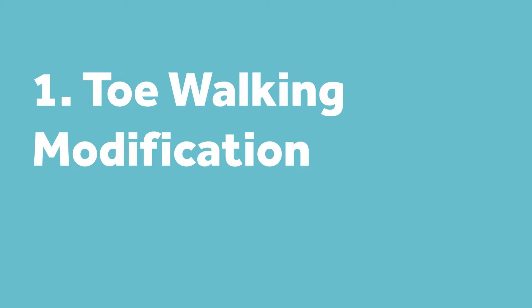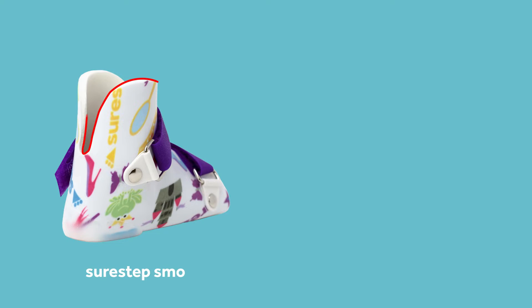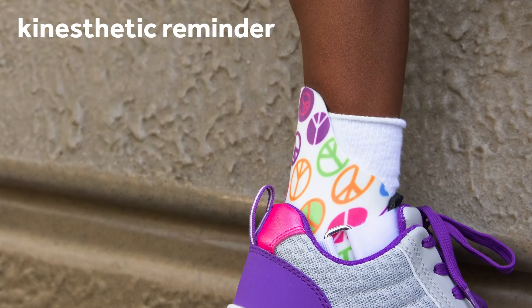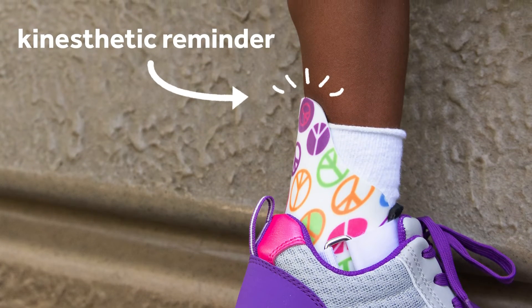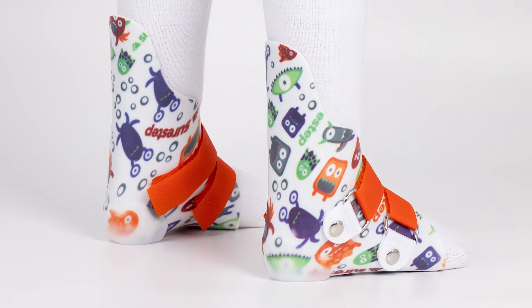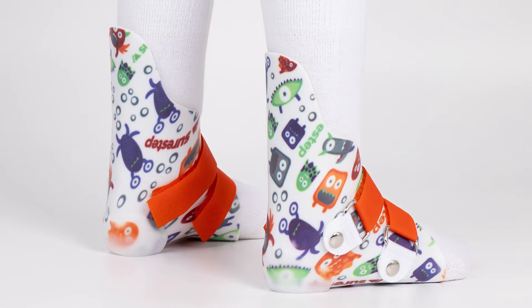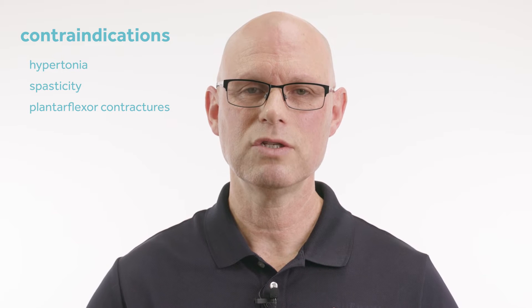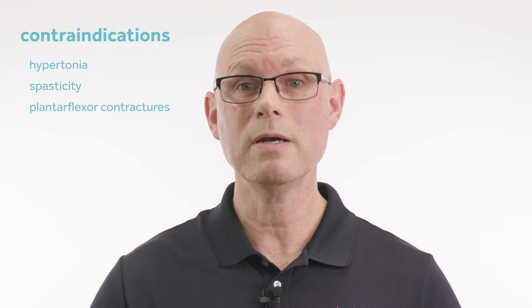I'll start with toe walking — maybe one of our most common modifications. The toe walking modification is basically a SureStep SMO, but instead of having that dip in the back, it has an extension — we call it a posterior extension. The purpose is to be a kinesthetic reminder. When the child goes up on their toes, it digs into the back of the leg, into the Achilles area. It's not designed for a high-tone child; it's designed for someone who is correctable. It's just a reminder so the parent doesn't have to tell them to get their heels down — the brace will do that for them.